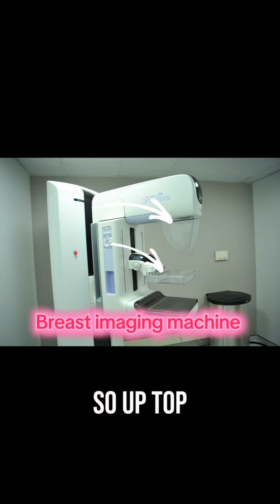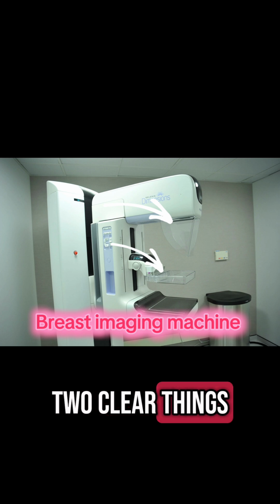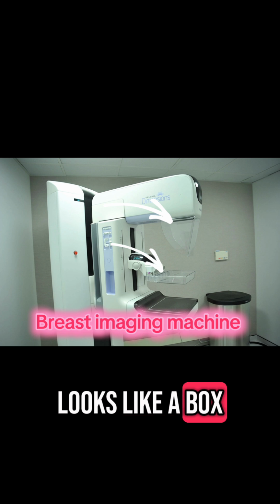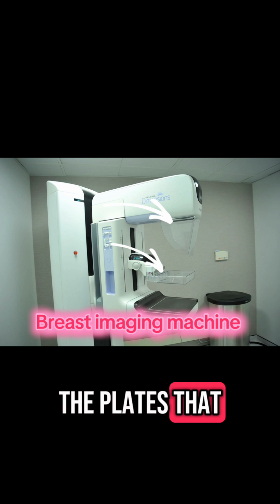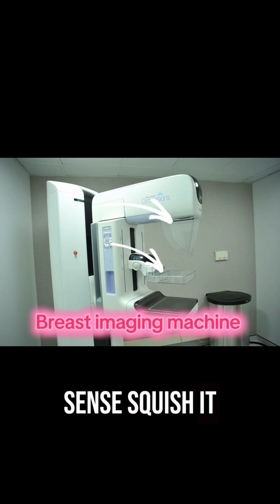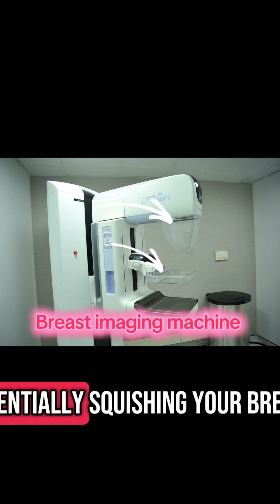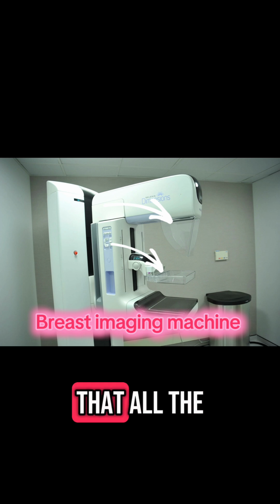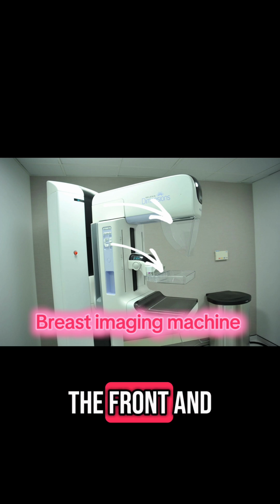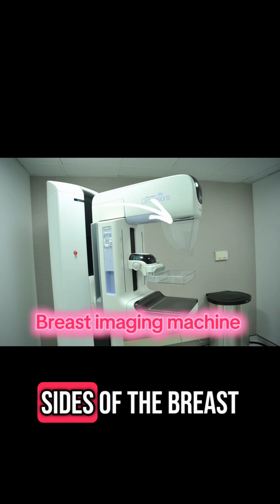So up top you can see 2 clear things, and in the middle you can also see another clear thing that looks like a box. Those are actually the plates that will hold your breast in place, or in a sense squish it. The reasoning for the plates and essentially squishing your breast is to ensure that all the different angles are accounted for, whether that be the front and top of the breast or both sides of the breast.